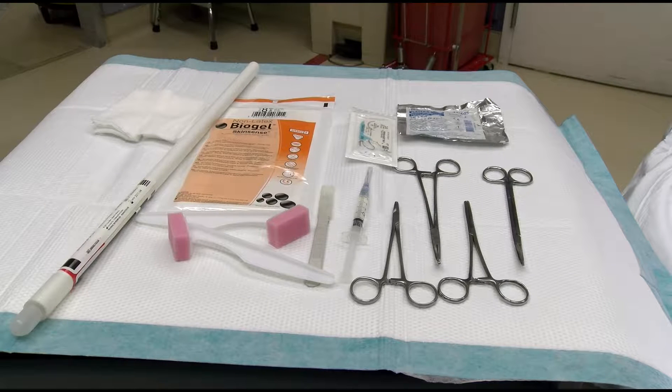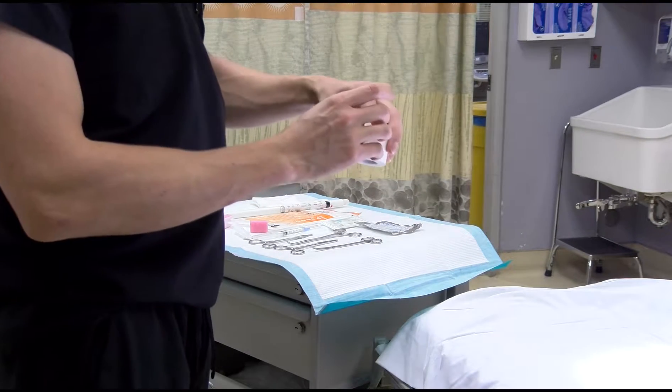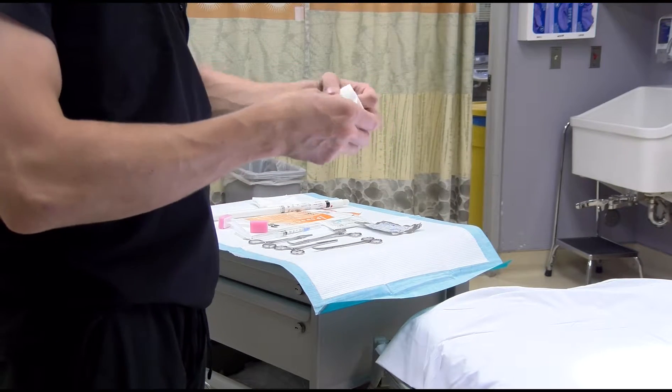Before beginning the procedure, open your chest tube kit and ensure you have the correct supplies: a skin cleansing agent, lidocaine, sterile gloves, a curved hemostat, a tube clamp, a number 10 blade scalpel, scissors, a needle driver, 2-0 silk suture, Vaseline gauze, standard 4x4 gauze, and tape to secure the chest tube, as well as a chest tube drainage kit. Also ensure that you have selected the correct size tube for use in your patient.